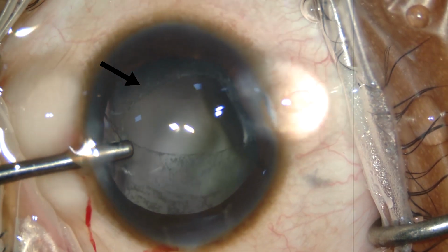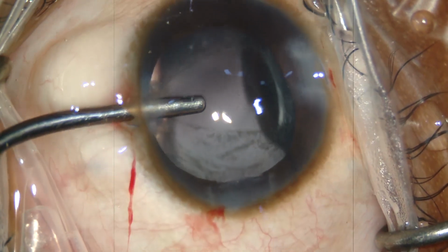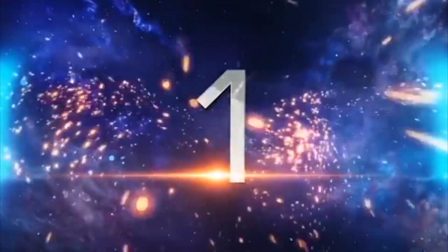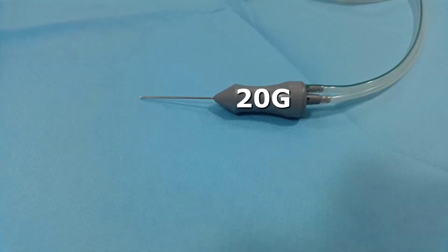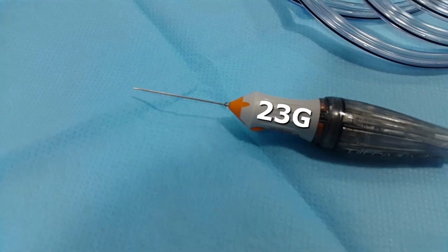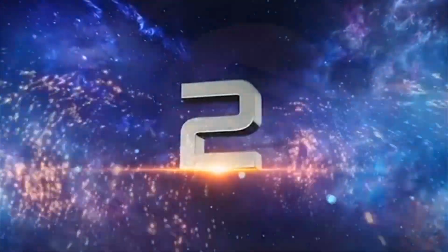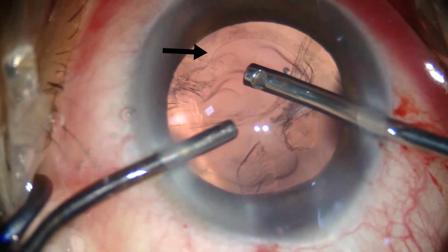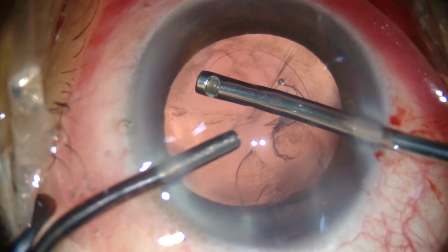Once you have a PC tear with a vitreous loss, there are 4 important points to remember. Number 1 is a vitrectomy cutter, which could be in 20 gauge, 23 gauge, or 25 gauge and should be used appropriately. Number 2 is to use bimanual vitrectomy, that is, have 2 ports, one for infusion and anterior chamber maintenance and one for the cutter.